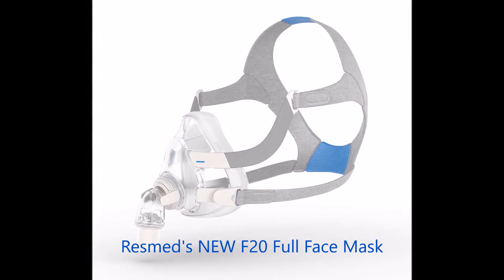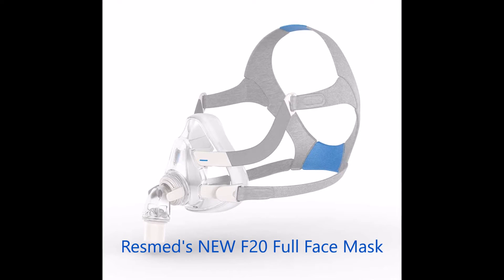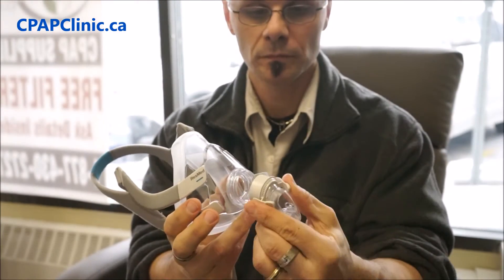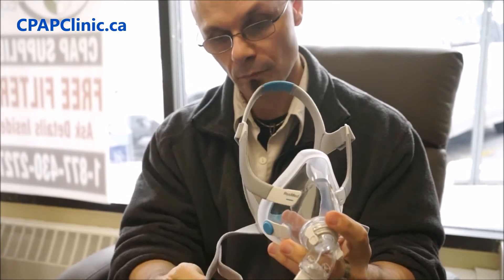When I wore the F20, one of the first things I noticed was how comfortable it was against my skin — not only from a mask cushion point of view, but from a headgear point of view. The headgear is so plush that it would take constant pulling and stretching in order for anything bad to happen to it.